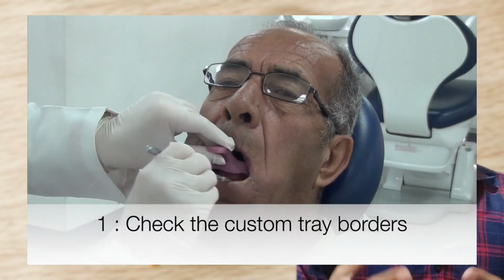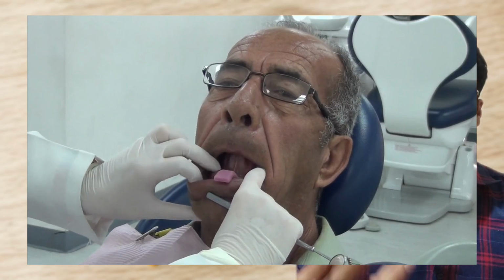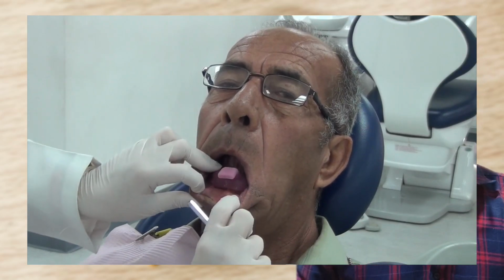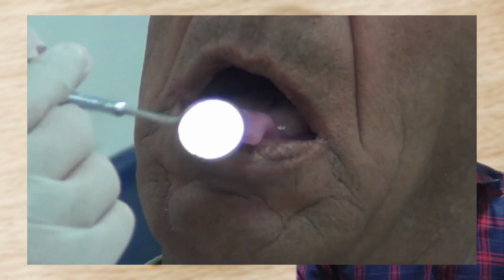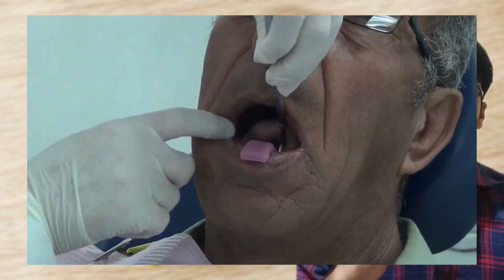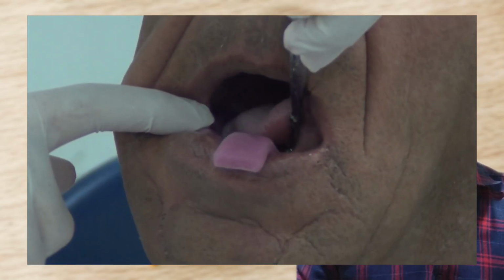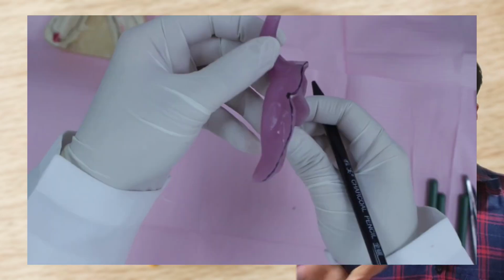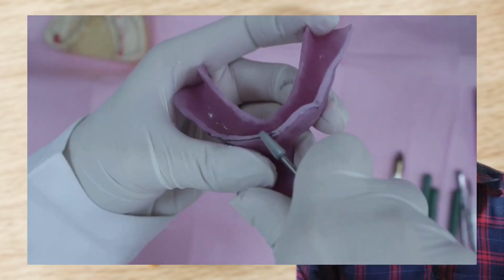Now place the custom tray in the oral cavity and observe the extension. Is your custom tray lifting while the patient protrudes his tongue? Your lingual flange is overextended posteriorly. If it lifts when you pull the cheeks, your buccal flanges are overextended. Ask the patient to touch the tongue to the upper lip. If it lifts, your lingual flange is overextended. If it gets lifted when the patient opens the mouth wide, the retromolar pad area is overextended. Trim all these areas. You will be surprised to see how much overextended trays we make.